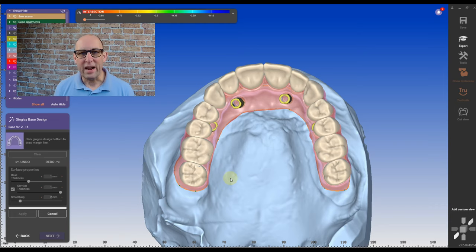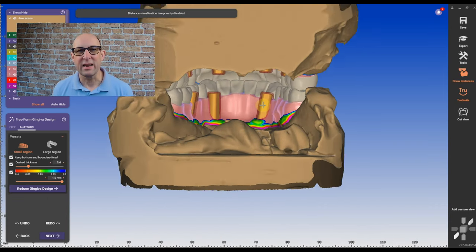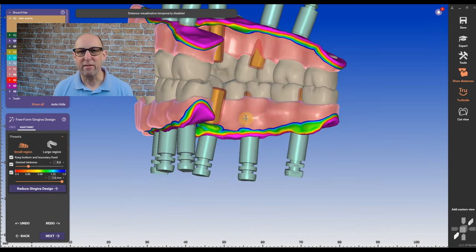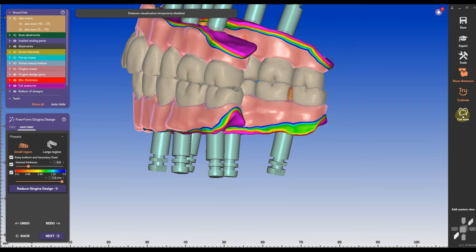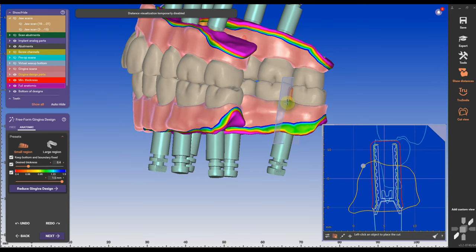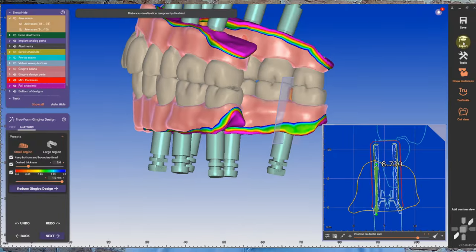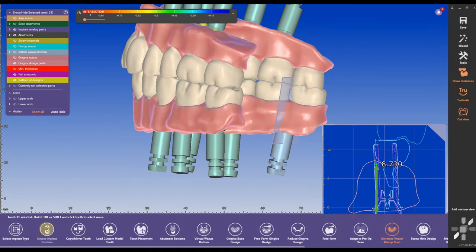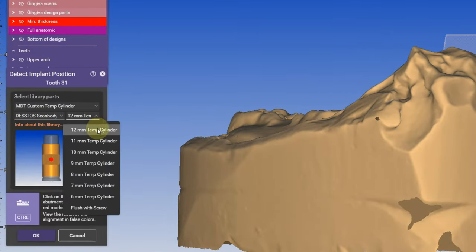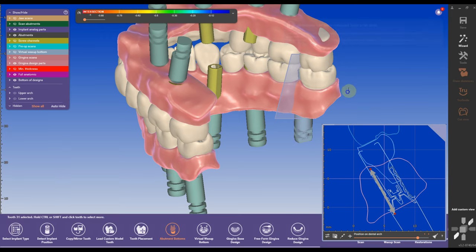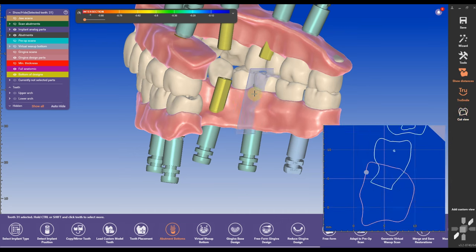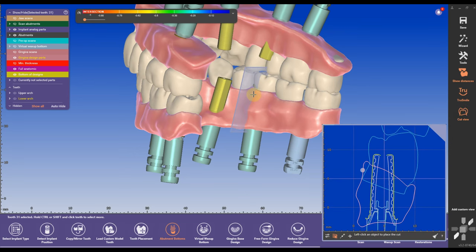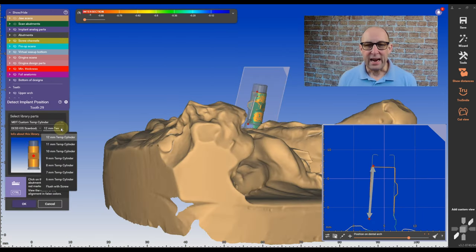When we go into the gingival free-form design, we can already see the problem that we have with guessing the height of multi-unit temp cylinders. When we measure the total height from the base of the temp cylinders to the height of the tissue, we can measure here in this example it's 8.7 millimeter. We can then easily swap it out to an 8 millimeter tie base to make it not come out of the incisal or not come out of the occlusal of the teeth.